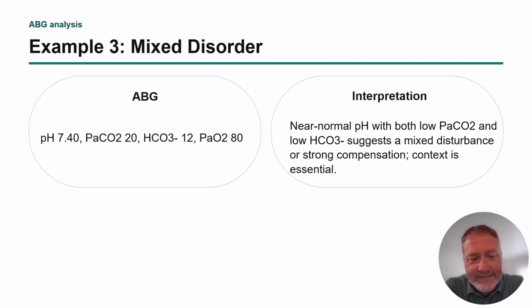But anywho, all right. So let's take a look at this one. We've got a pH of 7.40, so that is perfectly normal. If you stop there and you assume that they're fine because their pH is normal, well, you're missing two big pictures. With the pH of 7.4, you would expect the PaCO2 to be either 40 or greater. Greater if they've got some sort of CO2 retention, or somewhere in the normal range.